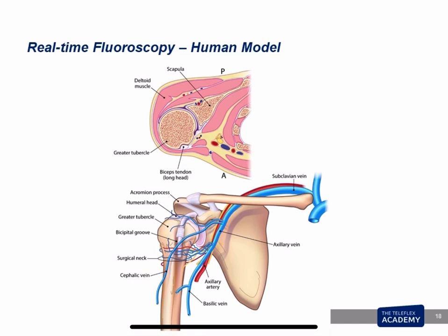So there's deltoid muscle and skin and adipose, but the axillary nerve, artery and vein, brachial plexus, all of that is more medial in the axilla. And where we're placing the IO on the anterolateral part of the arm is far away from any of these important structures. In the diagram, you'll see the greater tubercle pointed out, and that's the target of insertion.